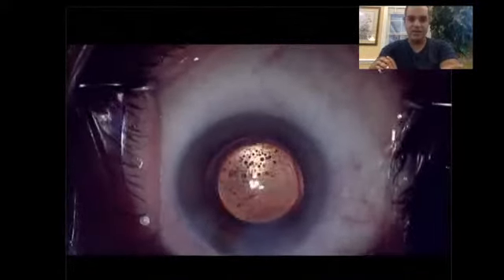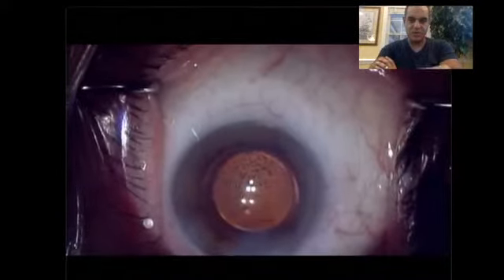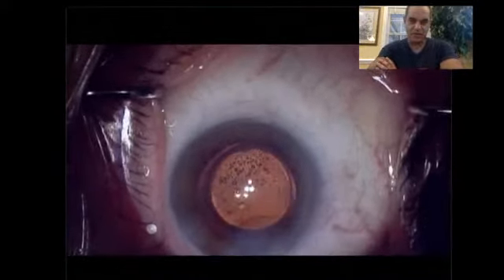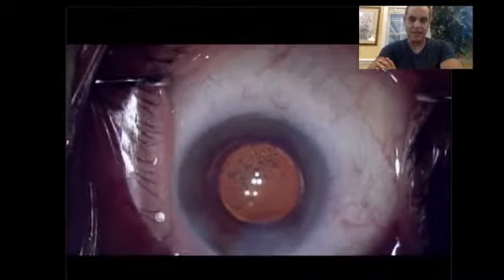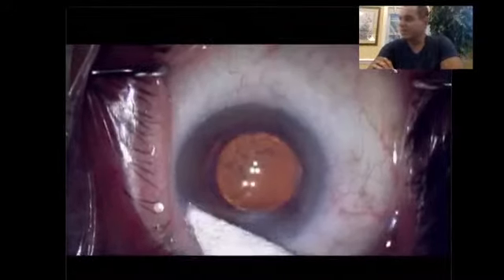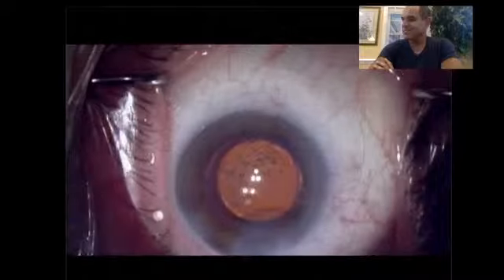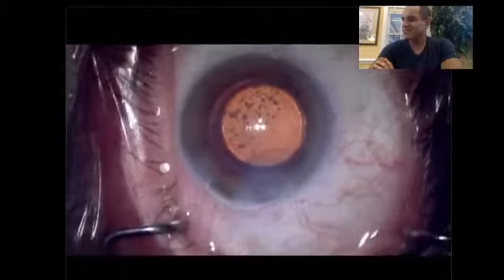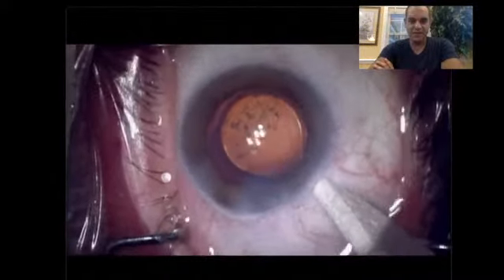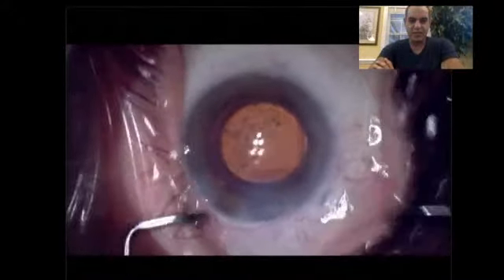And that's really about it. I believe for this case we'll check the wounds, which is not visible here on screen, and then I check the intraocular pressure with the back of the 30 gauge cannula. And that's really about it for the case. I depress on the globe, just make sure the wounds are watertight. And this patient has just had a successful cataract surgery with an iStent Inject.